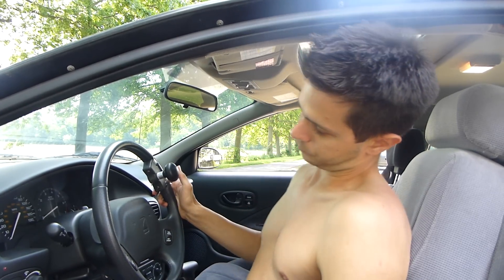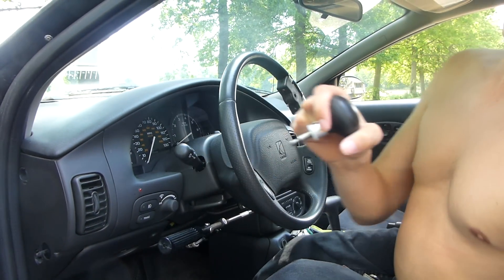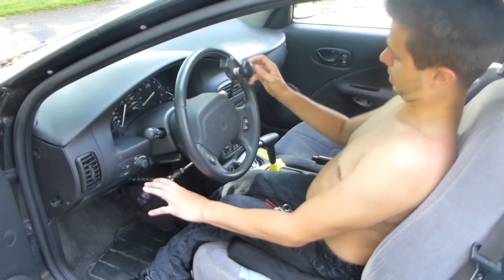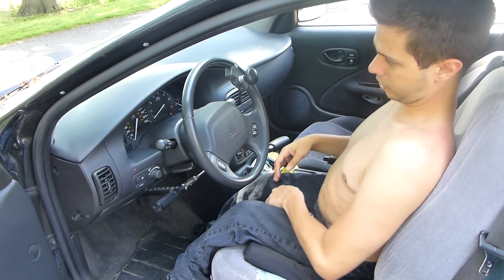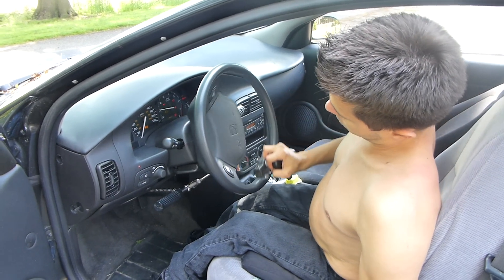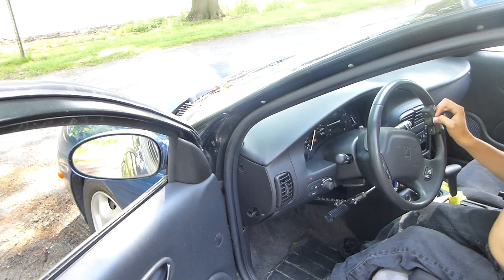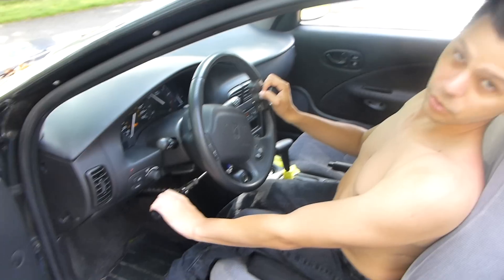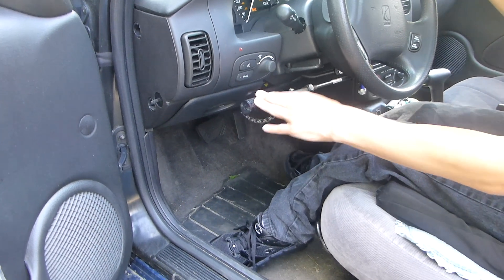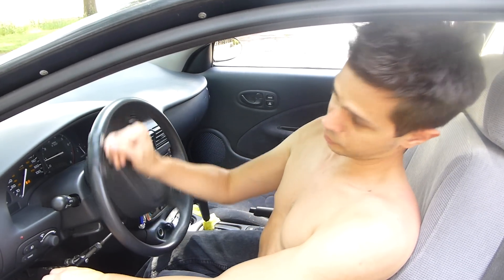I also have this thing — it's a spinner knob. Let me turn the car on so I can show you. It allows me to turn the wheel with only one hand, because obviously if I need one hand for gas and one for brake, I'm not going to be able to use both hands for a turn. So I need this to be able to turn with just one hand.